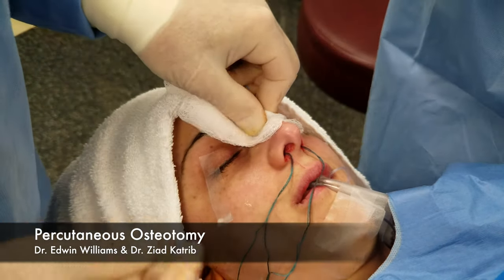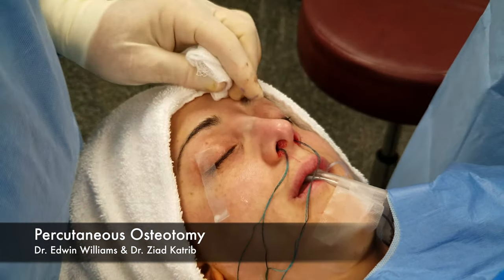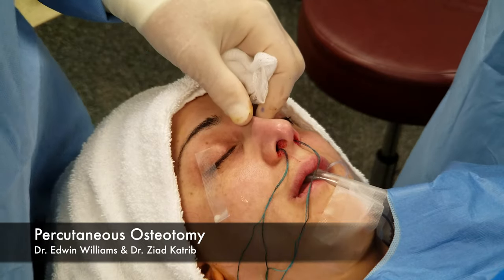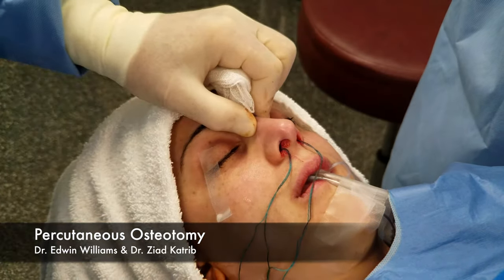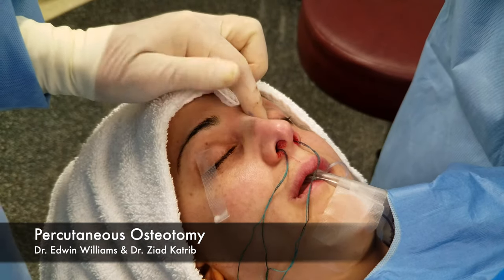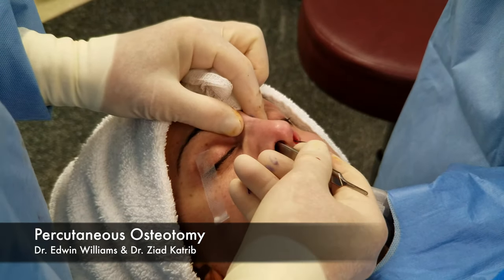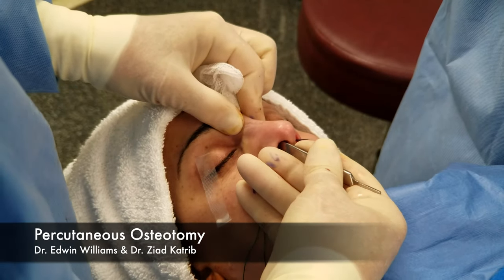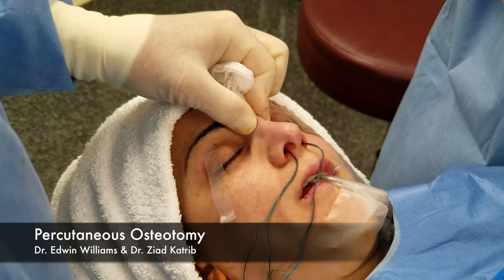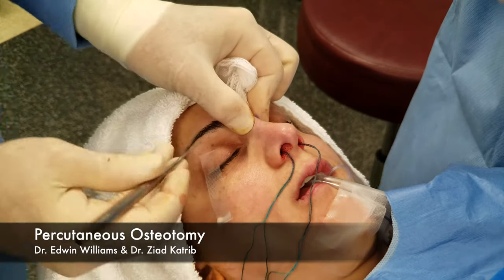This is where the two millimeter percutaneous osteotome works nicely. With the percutaneous technique, I feel where it's being tethered — I can feel it right here. I mark it, and then I go right through the skin with the two millimeter osteotome.